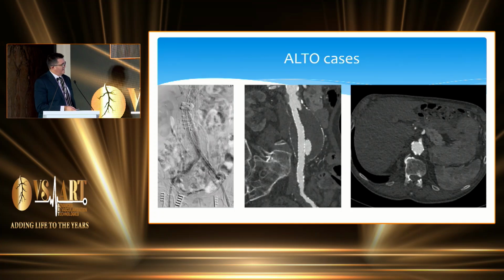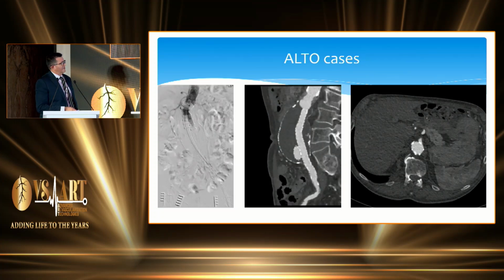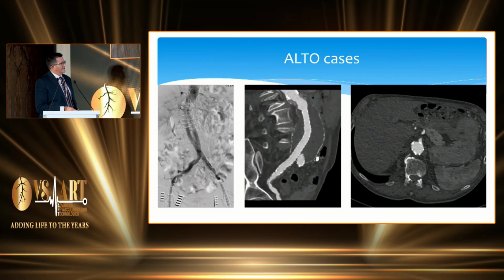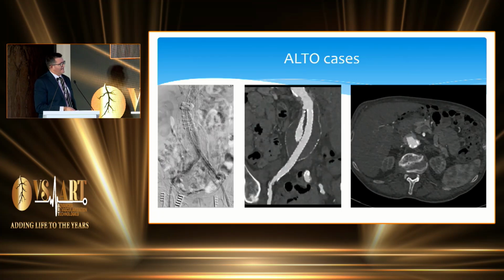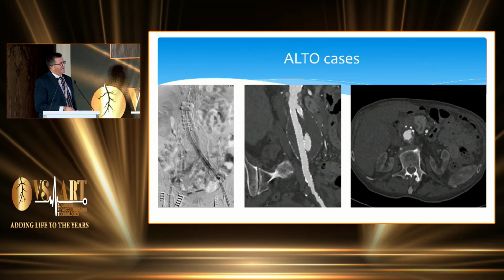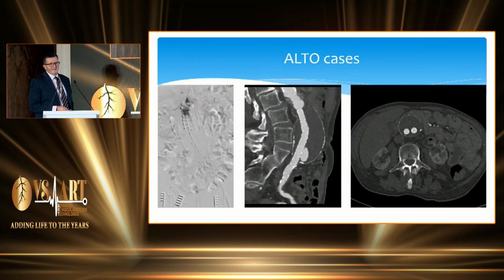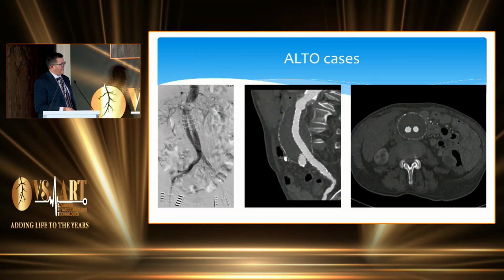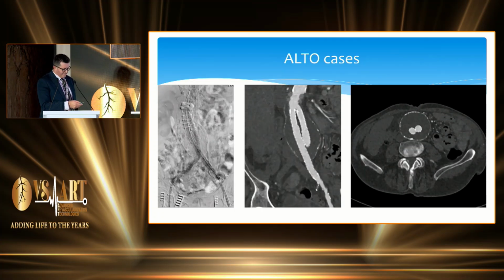And it looks a bit like this. Can you run the other two videos if you could? Thank you. And the other one if you could. So this is what it looks like. It looks a bit odd at the top end, and when you look at these in surveillance, it can look as though the neck of the graft is stenosed, especially when it's angulated. It can look like there's a 50% stenosis in there, but the graft is actually fully open.